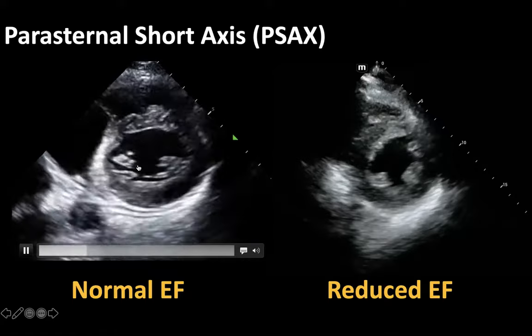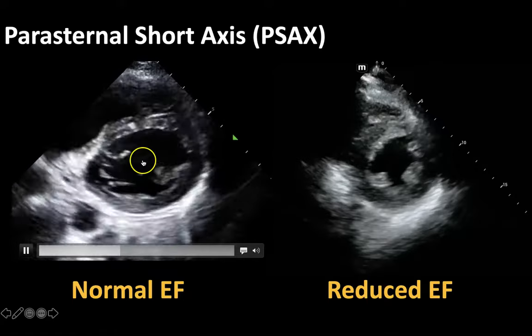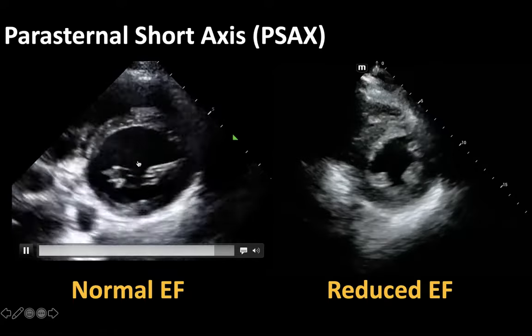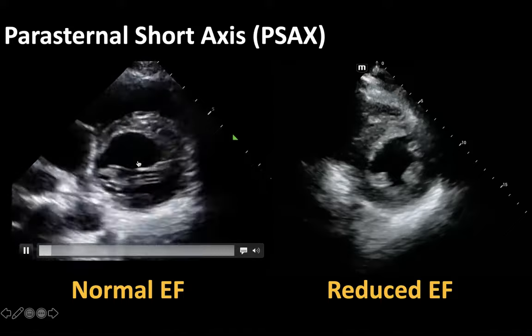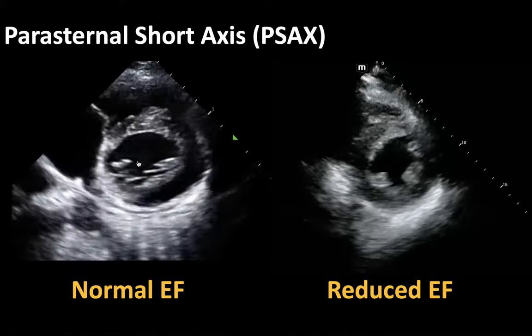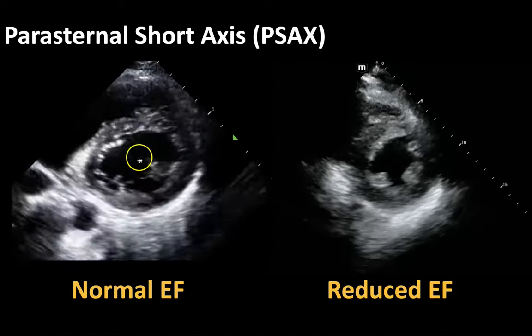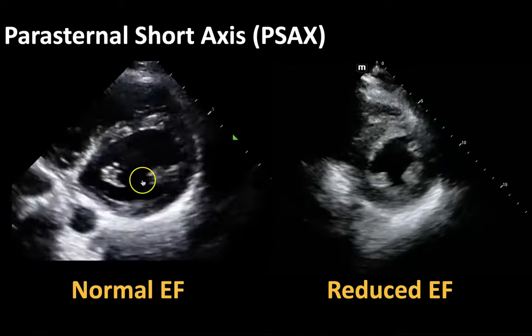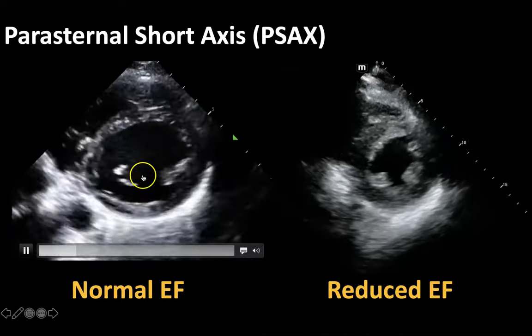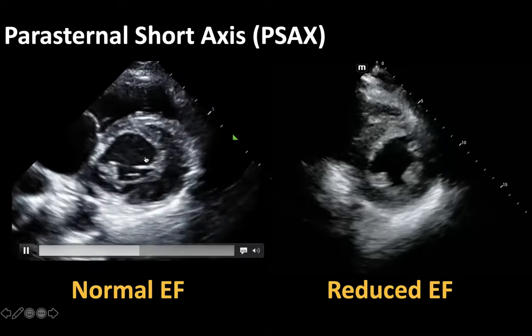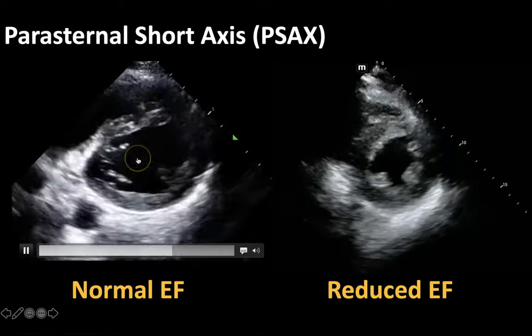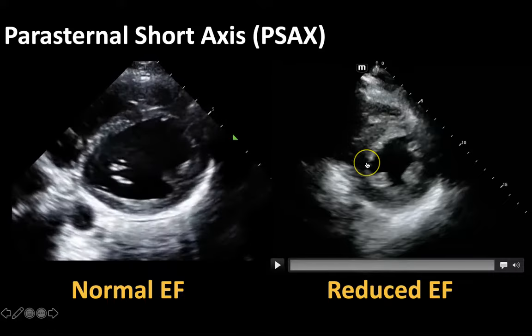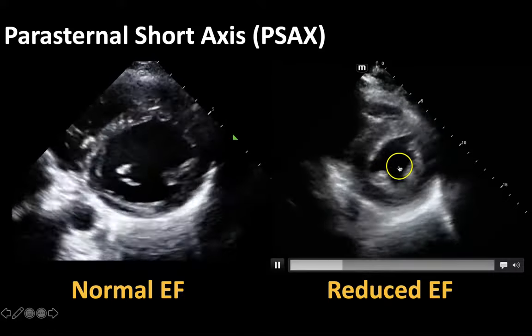Here you can picture putting your finger in the center of this left ventricle and seeing how well the walls come in towards that center to see how well it's squeezing. This heart on the left side of the screen has a normal ejection fraction because you can see that the walls are coming reasonably close to the middle of the screen.